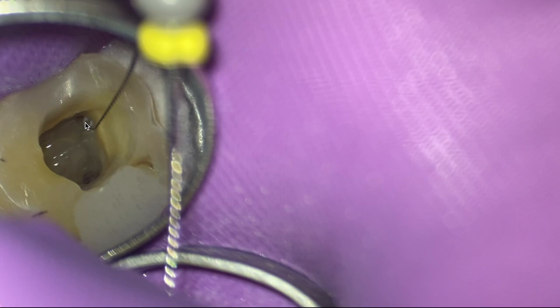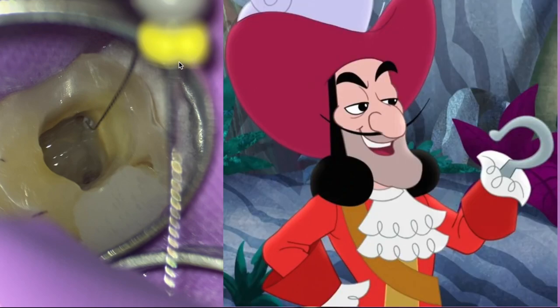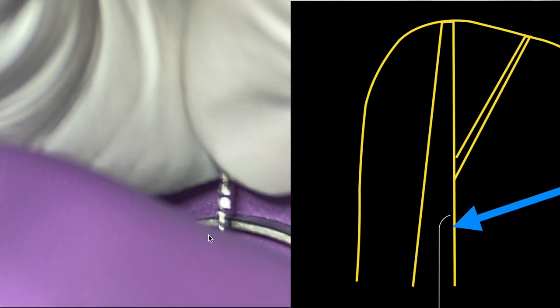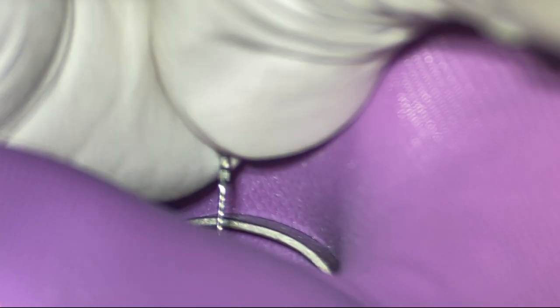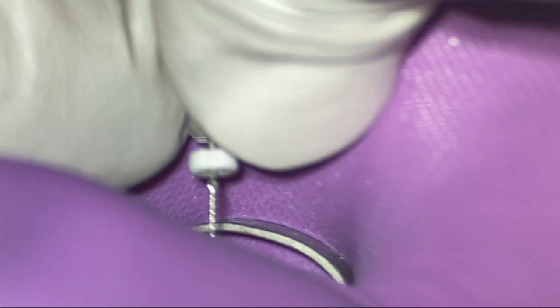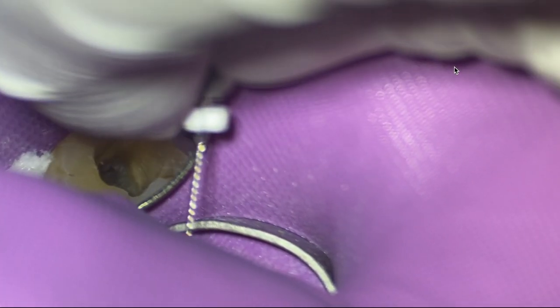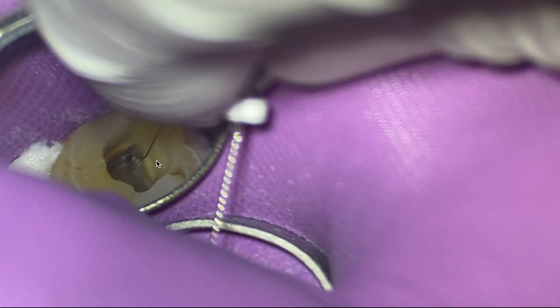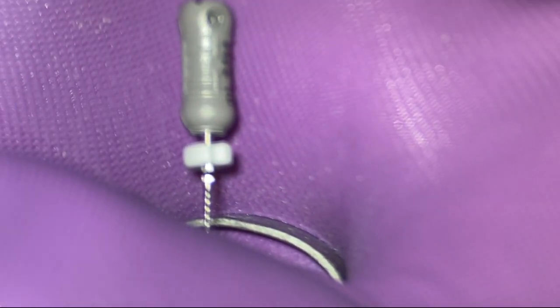What I'm doing is I'm just scooting that along the mesial lingual side of that canal and I'm just trying to feel to see if I get any bite or not. The working length is roughly around 16 mils. I'm trying to feel for any type of catch. I get nothing, like literally nothing. So I'm going to use my Apex locator. I don't get a catch. I'm kind of like, well, what should I do? So I'm going to use another file, this is a C plus file. It's a little stiffer.